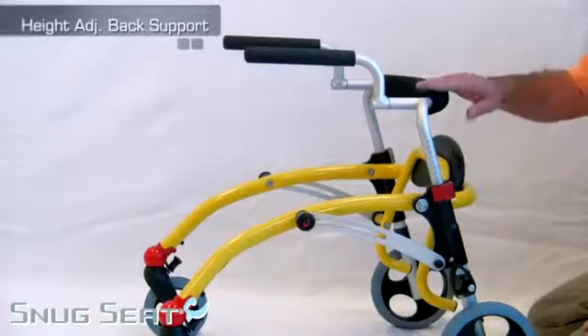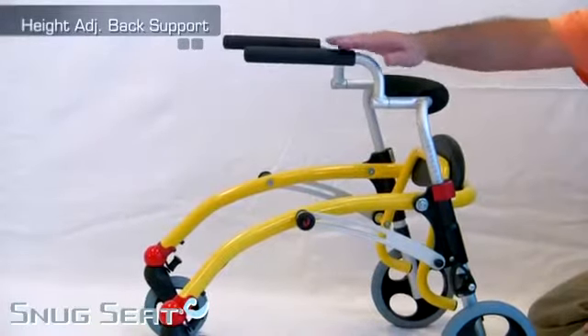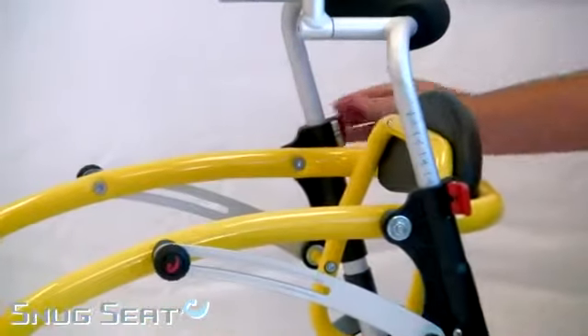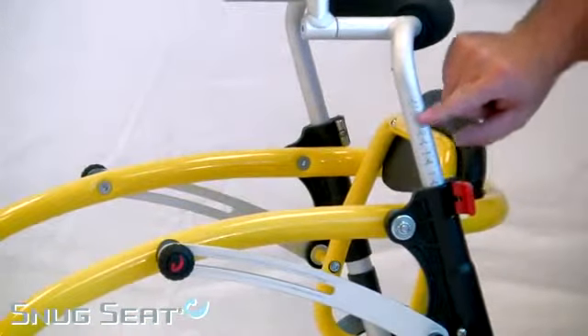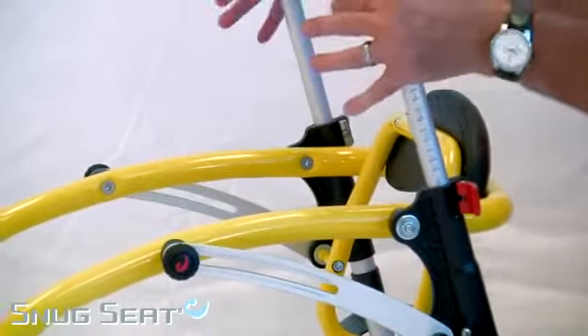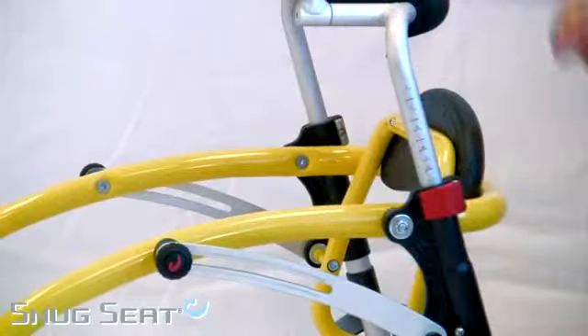The Crocodile has a height-adjustable back support for the handles. Simply open the red lever — it is marked for height adjustment — and adjust it up or down depending upon the size of your child.